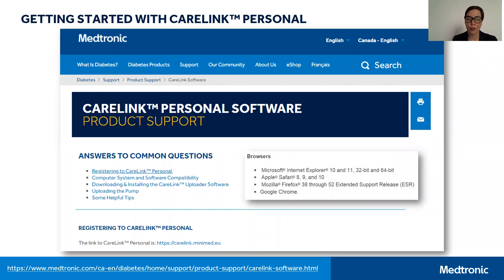All of these resources can be found on the Medtronic Diabetes Canada webpage at www.medtronicdiabetes.ca. From there, you'll want to click on Support, then on Product Support, then on CareLink Software, and you'll see the page that is on the screen in front of you. Here you'll find answers to all of the common questions about registering for CareLink Personal software, as well as computer system and software compatibility questions you may have.